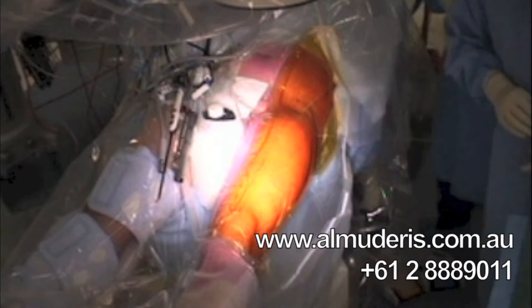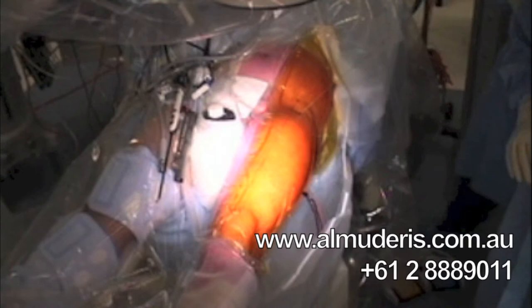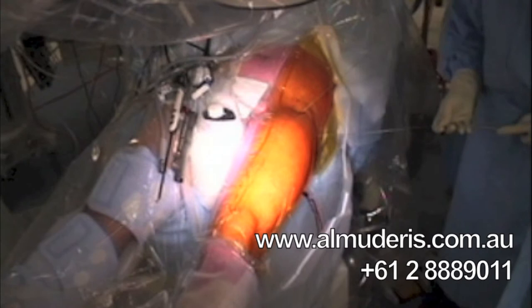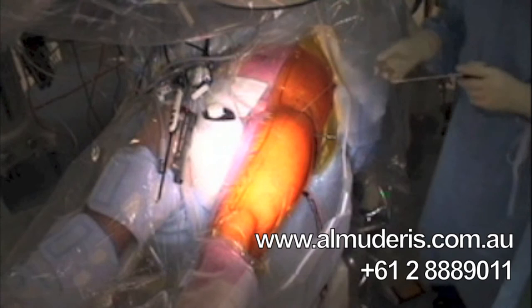One lateral, one anterior. It has to be lateral to the anterior superior iliac spine to avoid damaging any of the branches of the lateral femoral cutaneous nerve. And then I use the smaller trocar that allows the camera to be inserted gently into the hip joint. I remove the trocar and leave the cannula, and you can see flow is coming through the lateral portal. That indicates that I was 100% inside the joint.